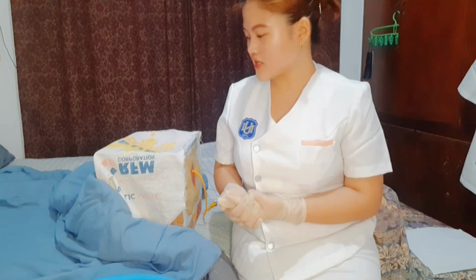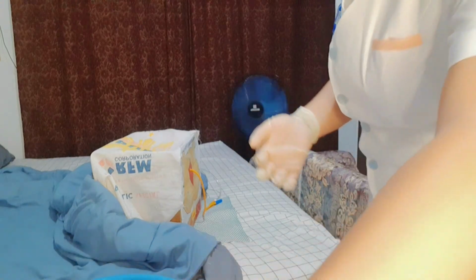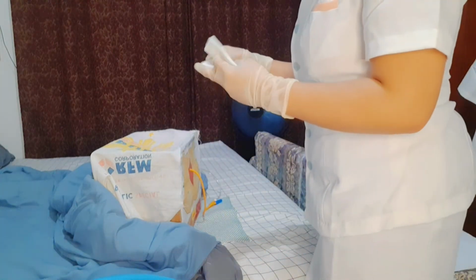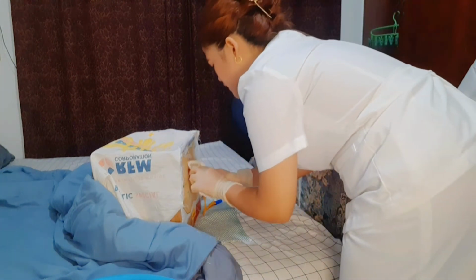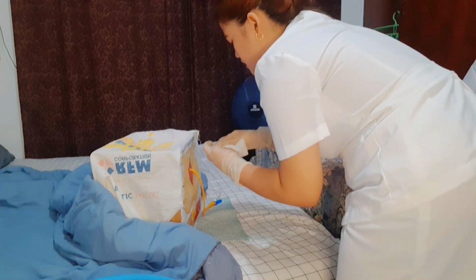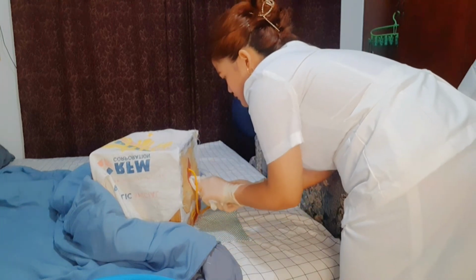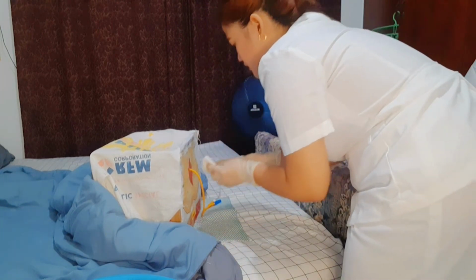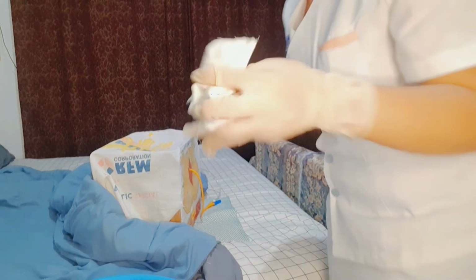And then you need to rinse and dry the genitals and also the perineum. So I have here the cloth which is dry. Using again the three strokes of the cloth. Okay. So from the center, then each side, and then the third one. Okay. And then dispose of it.